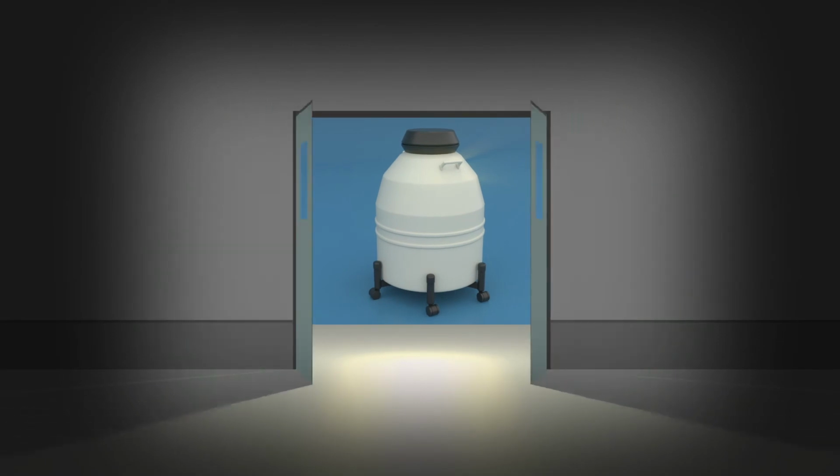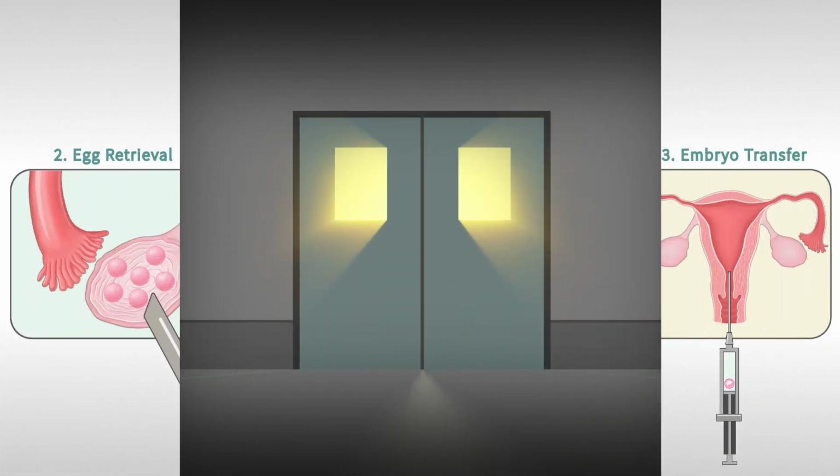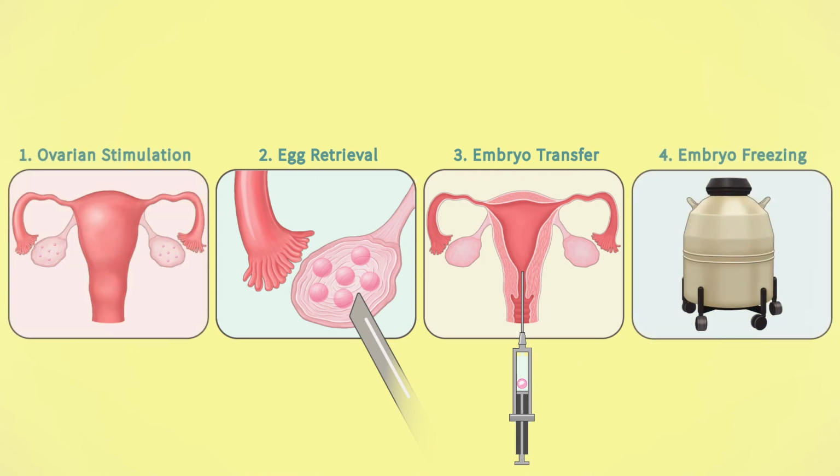Understanding what happens in the fertility lab between egg retrieval and embryo transfer doesn't have to be a black box. It's important to us, in working with you, that you are completely informed at every stage of your fertility journey.